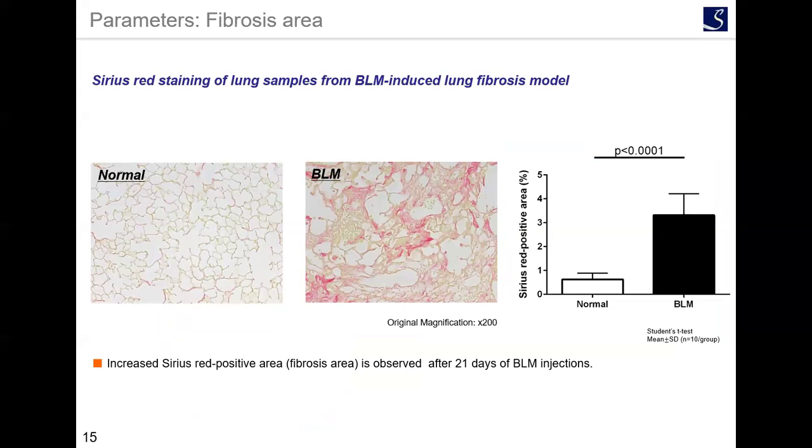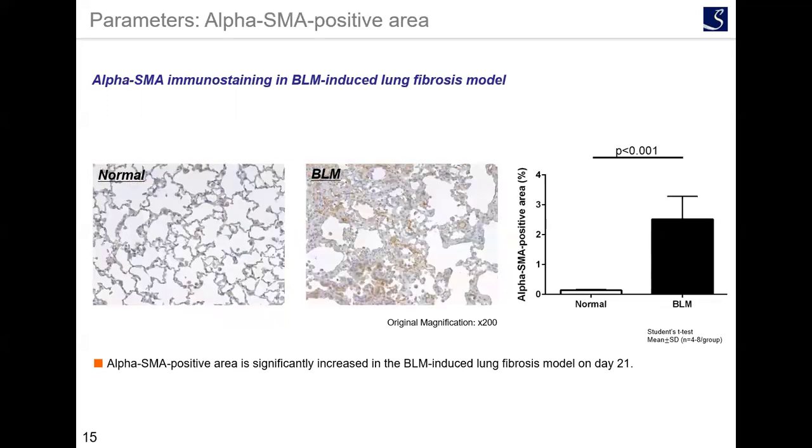Here we will look at some parameters for our IPF model. We evaluate fibrosis area by Sirius red staining, produce quantitative analysis based on the positive area. Here's a sample for alpha SMA immunostaining. Alpha SMA positive area is significantly increased on day 21.